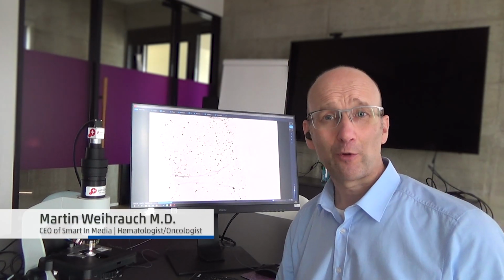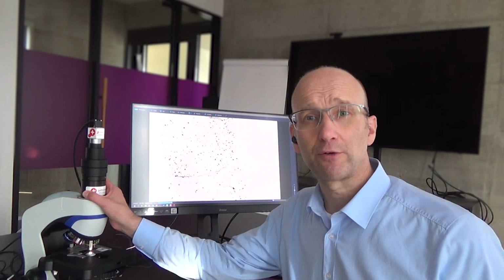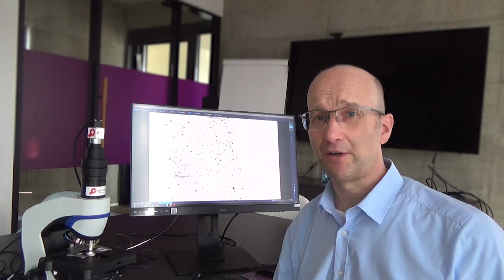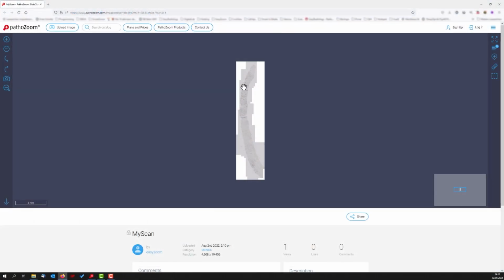Hi, with our intuitive software package, PathoZoom Scan LiveView, you can immediately digitize your own microscope and enter the world of digital pathology at a very competitive price. With PathoZoom Scan LiveView, you can immediately share a digital case with a colleague anywhere in the world.